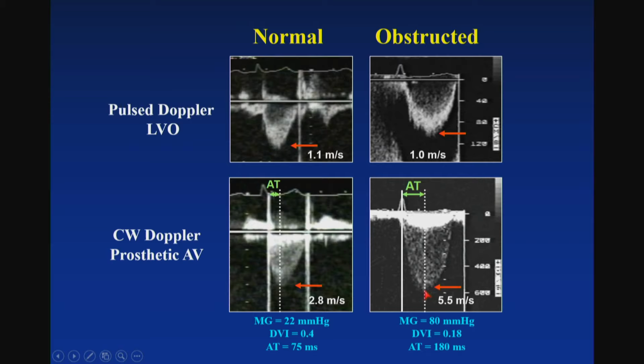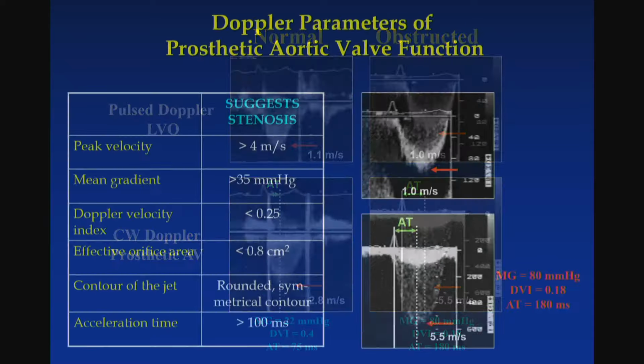Normally, this acceleration time should be less than 80 milliseconds. And if it is greater than 100, you start wondering. Certainly greater than 130 milliseconds, it's almost diagnostic of an obstruction. And this patient had 180 milliseconds.